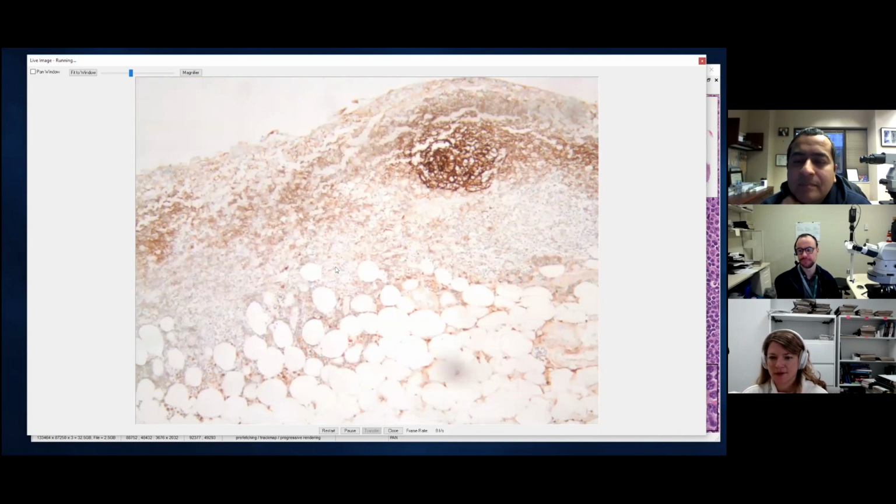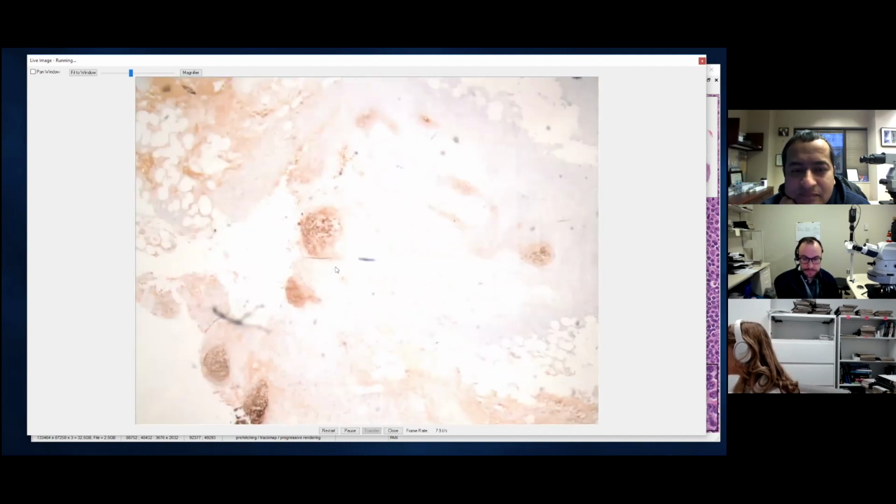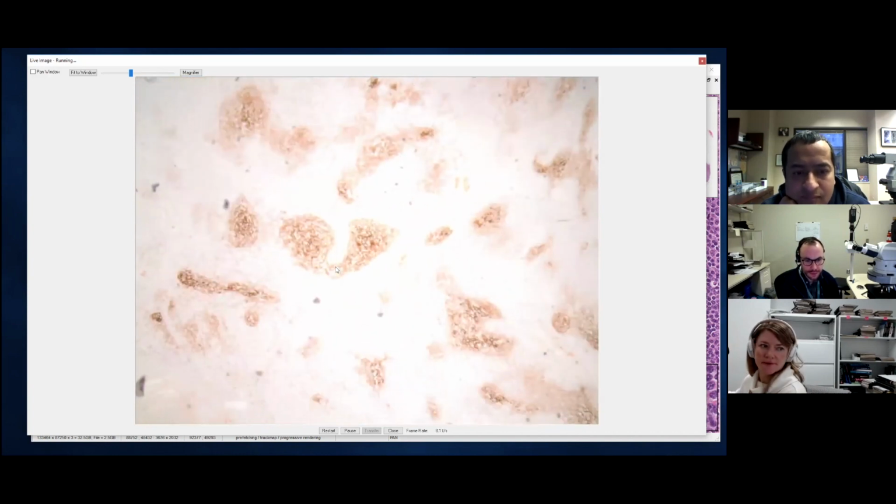Or sometimes you have an overrunning of the paracortex by something else, and you have really tiny germinal centers with very tight, small dendritic meshworks. But usually in a marginal zone, you're going to see, let's see if this will work, increased, slightly expanded or disrupted meshworks. And yeah, that's nice.